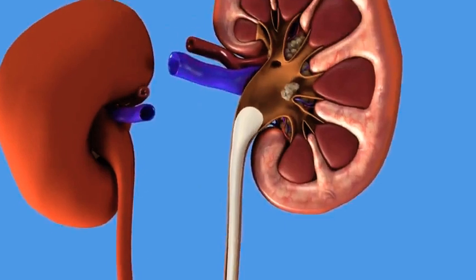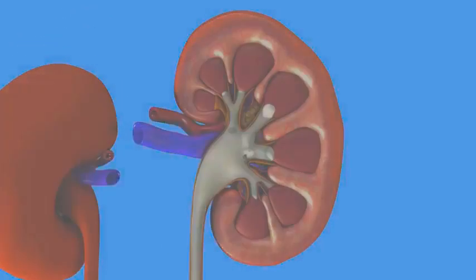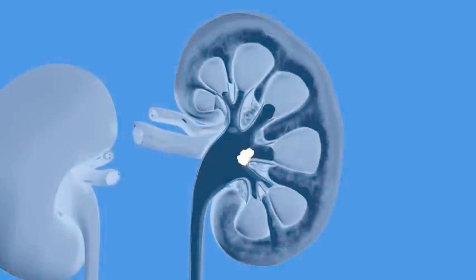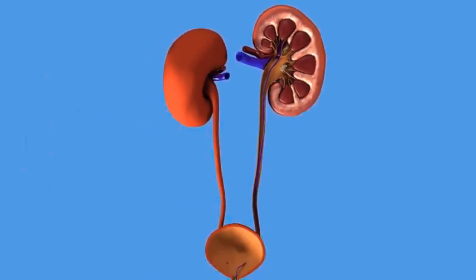A contrast agent, or dye, is administered through the tube into the ureters. X-ray images clearly outline the urinary channel and exact position of the stone. A so-called safety wire that helps guide the ureteroscope through the ureter is inserted.